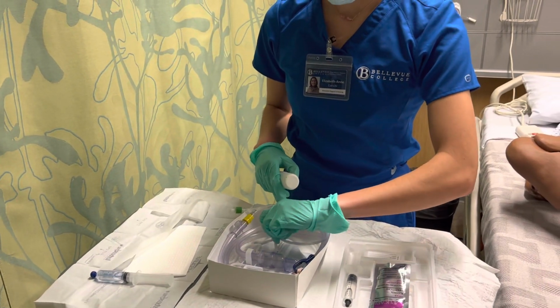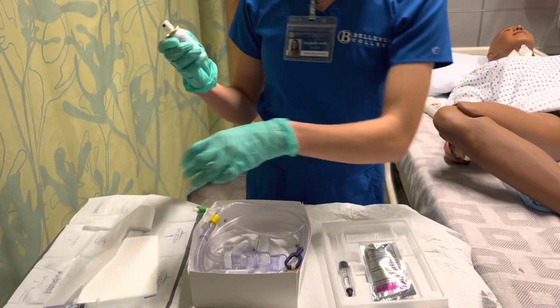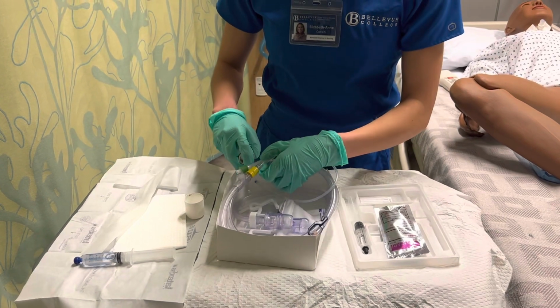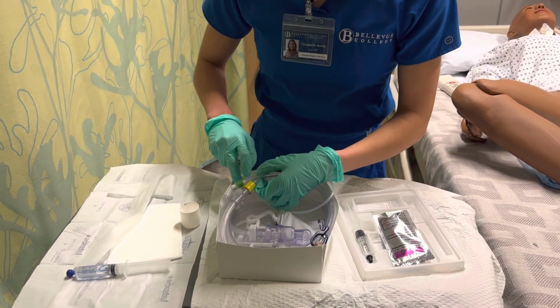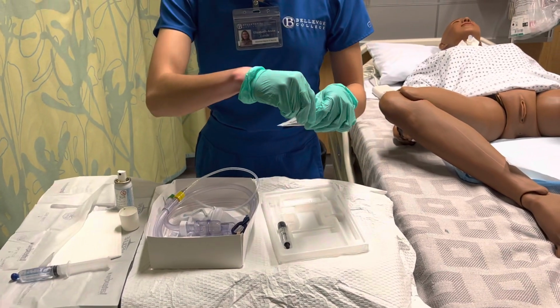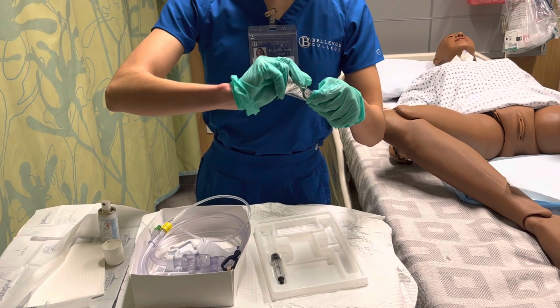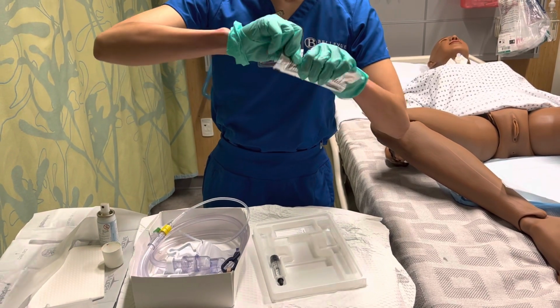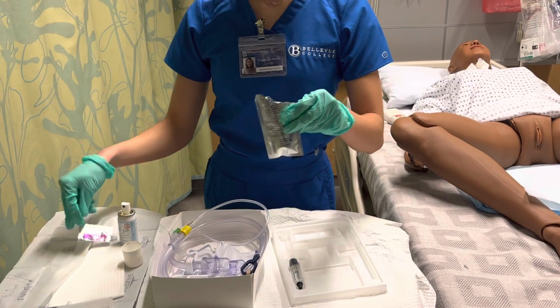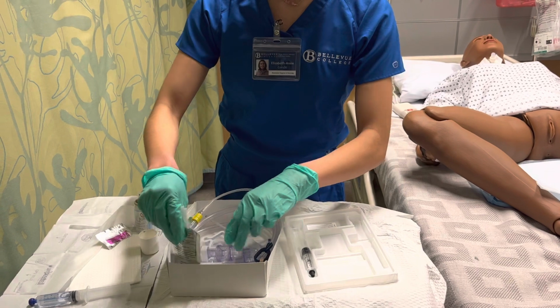Put this in the corner here, and we're going to lube with the Mani Lube. Set up our cleansing things here. That's nice and accessible for myself.